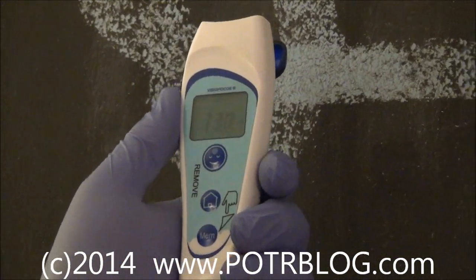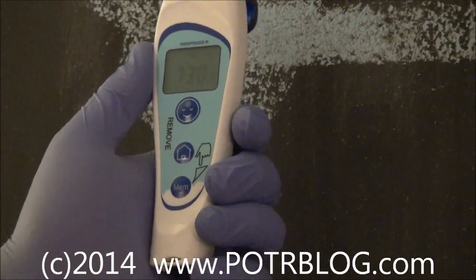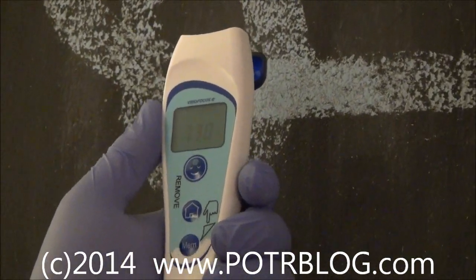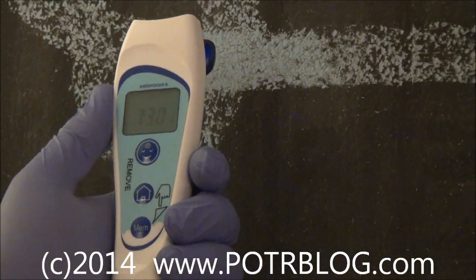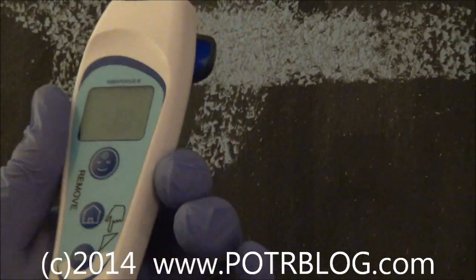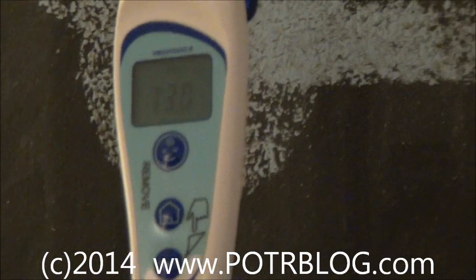The workaround is to actually take a reading off a person's eyelid with their eye closed. Supposedly this device does no damage to the eye if you look directly into it. It's a relatively expensive device, but it's really cool.